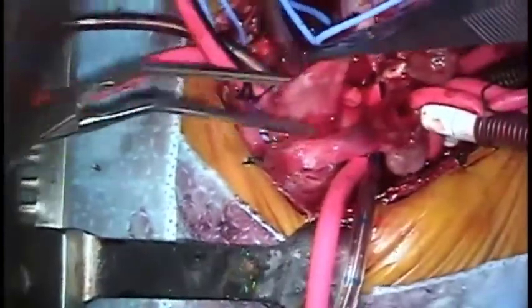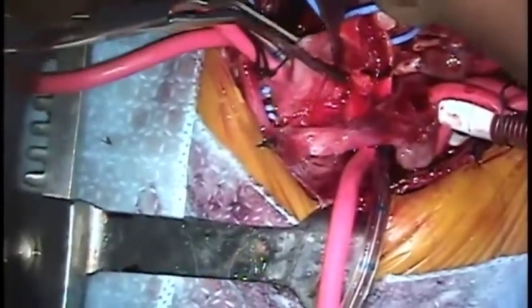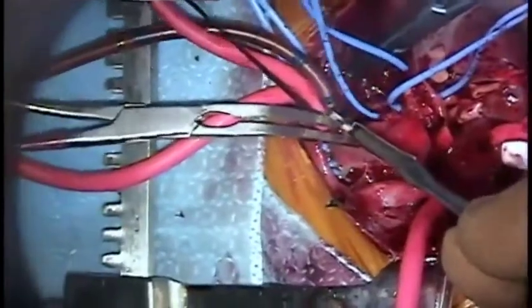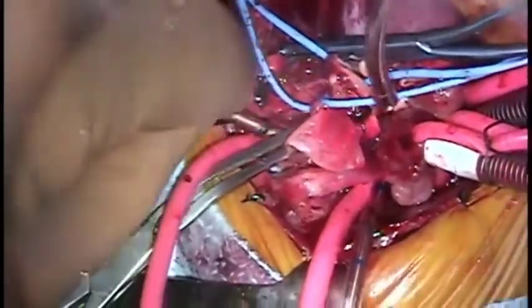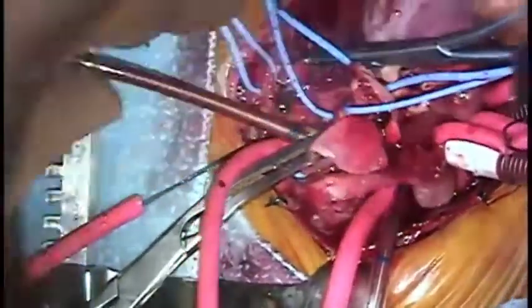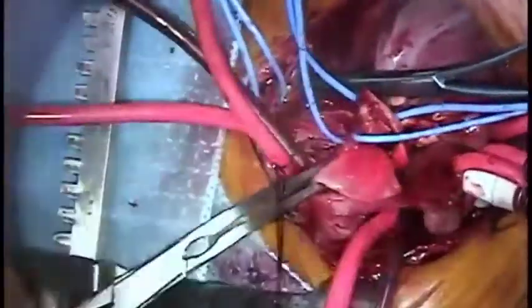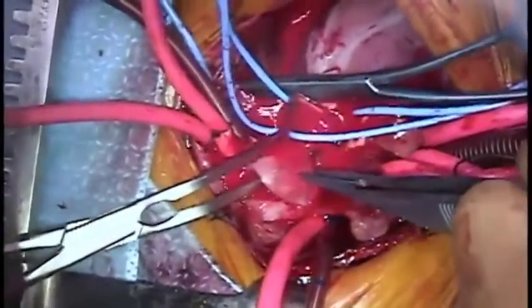The side-biting clamp on the descending aorta is removed and the cross clamp is applied. The circulation is arrested and the arterial cannula is withdrawn from the carotid and positioned in the descending aorta. The left carotid is snared. Note that the right carotid and both subclavians are still occluded. The patient is placed head down, pump flow is restarted slowly and the clamp is momentarily released to de-air the arch. Following this, the head and neck vessels are reperfused and full bypass is restarted.